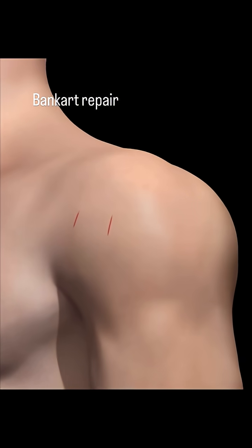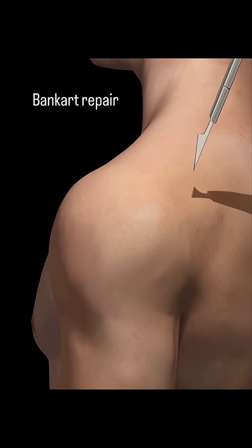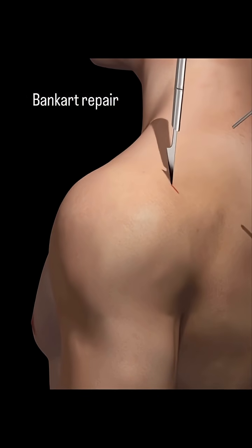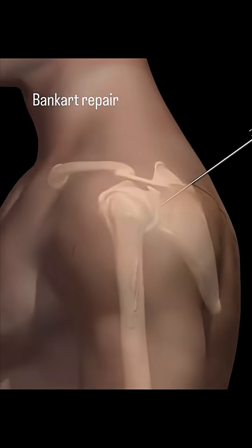Let's dive into the incredible world of orthopedic surgery with a procedure known as a Bankart repair. We begin with a detailed look at the human shoulder as a specialized surgical instrument makes its initial entry through the skin.